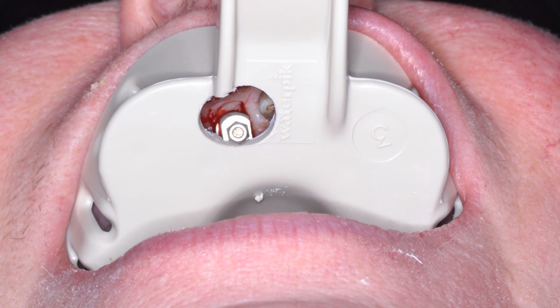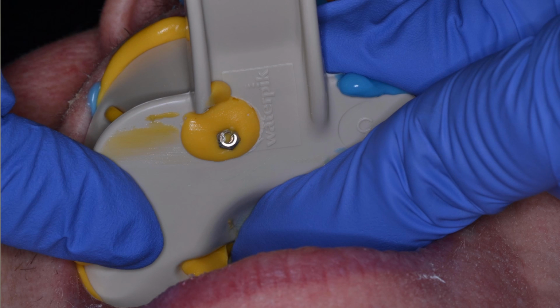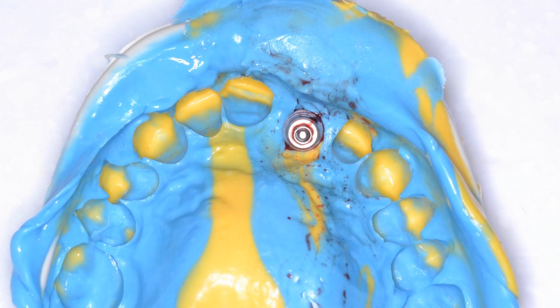We try that tray in, ensuring that hole is in the right spot for the impression coping. We fill up our impression tray with a combination, as I said, I like using a squirt of light body on the teeth and around the soft tissue for the implant, just to give the lab that much more information, along with the heavy body. Once it's all set, it's just a matter of making sure that screw head is not covered in impression material. Very important. Just take your finger and wipe it away, and then we unscrew that. And as you can see in this next photograph here, you have a gorgeous impression with a lot of detail, because we use some light body along with this heavy body for this impression.